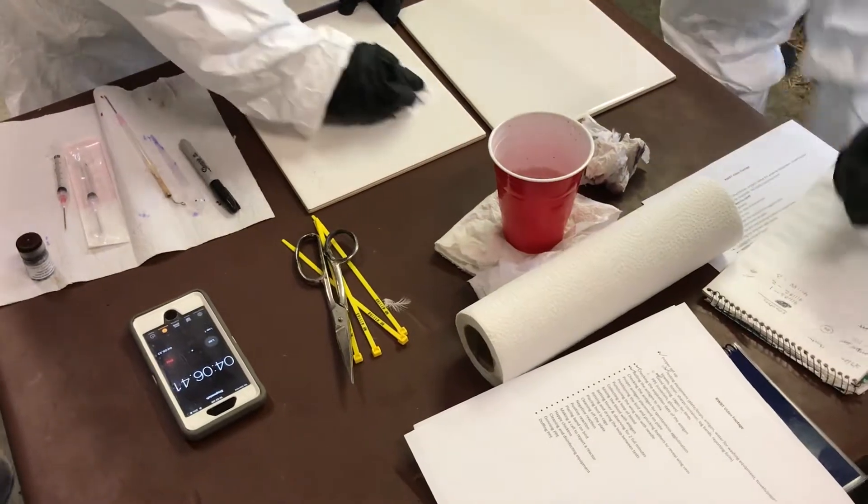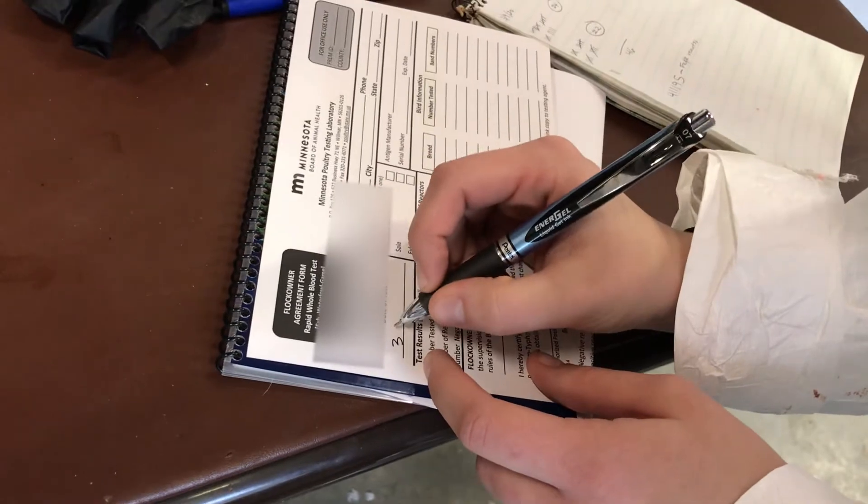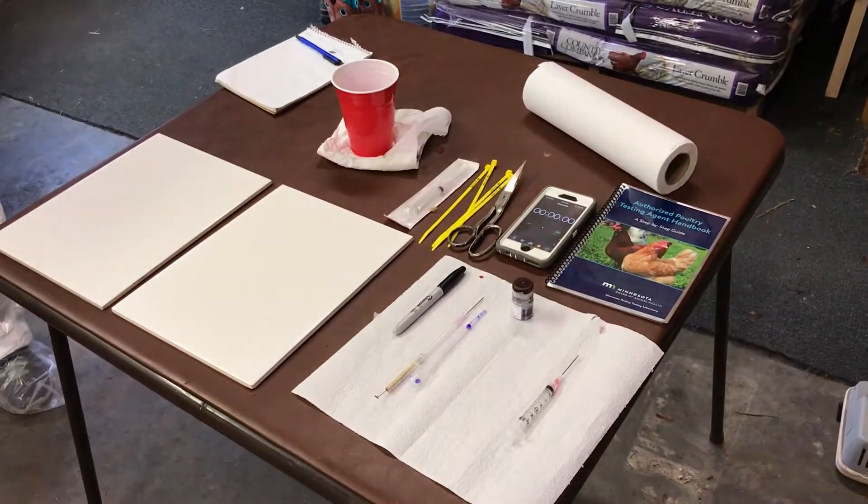It is important when conducting the rapid whole blood test that you have adequate testing supplies, people to help catch and hold birds, and everything ready and set up. Plan ahead.